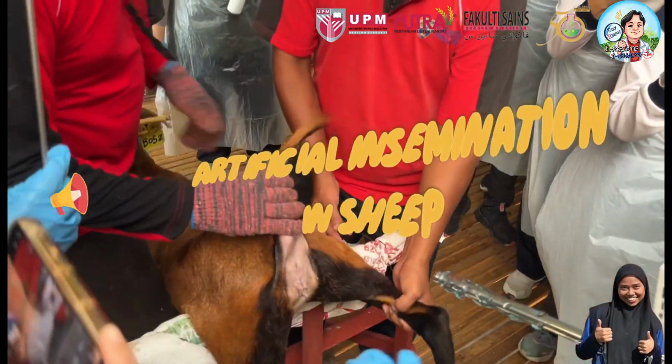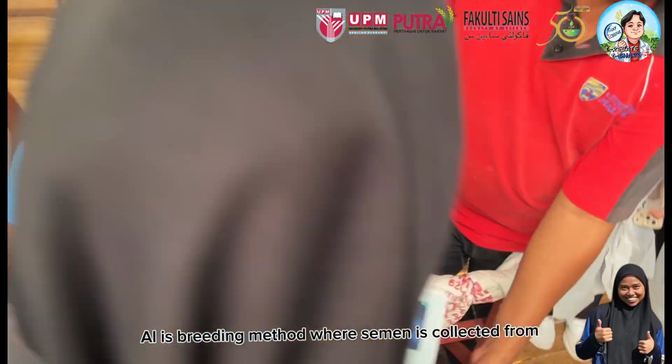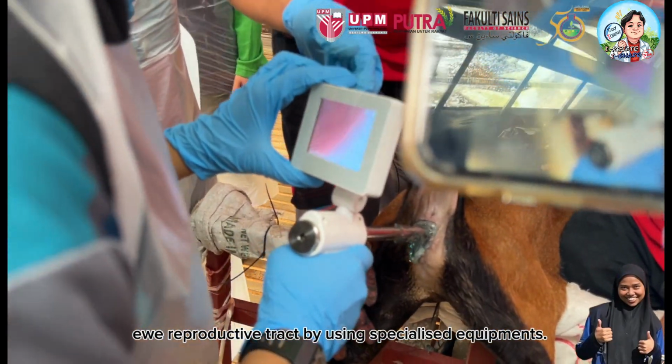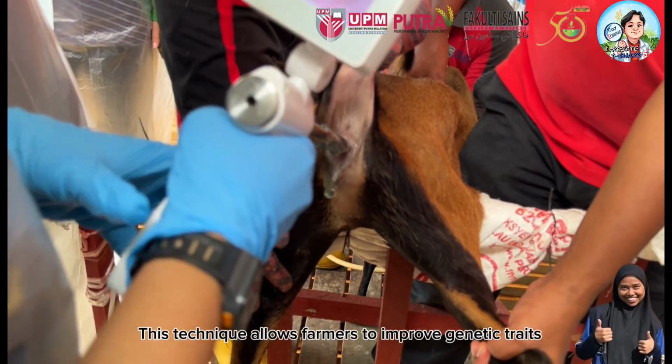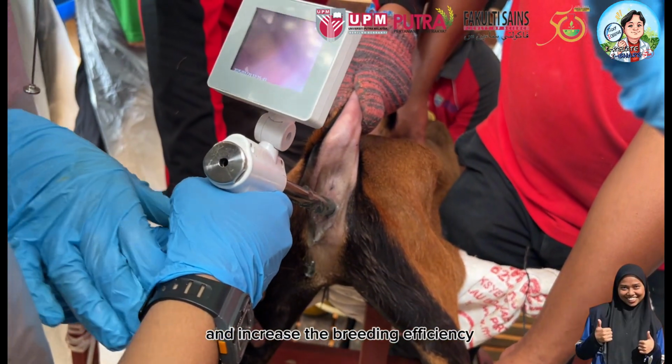Next is artificial insemination or AI. AI is a breeding method where semen is collected from a high-quality ram and introduced into a female reproductive tract by using specialized equipment. This technique allows the farmers to improve the genetic traits and increase the breeding efficiency.